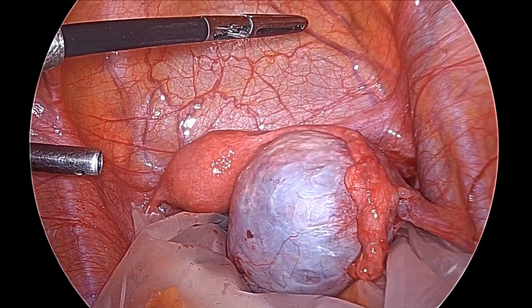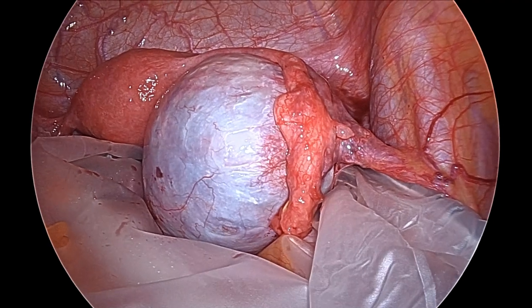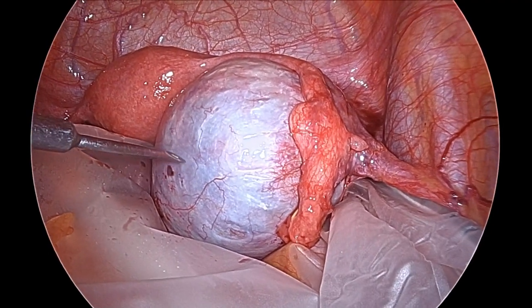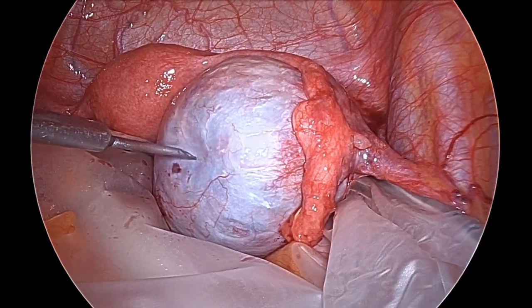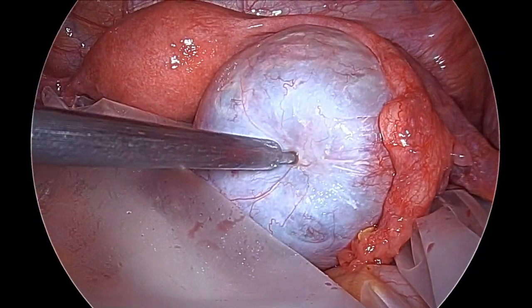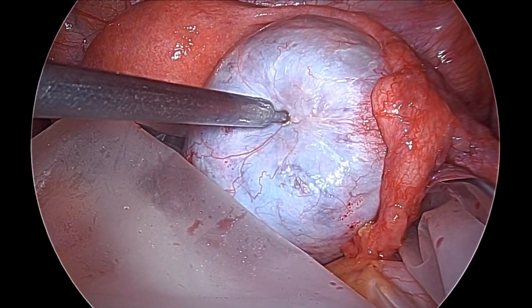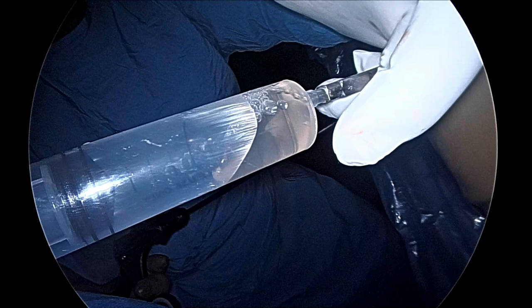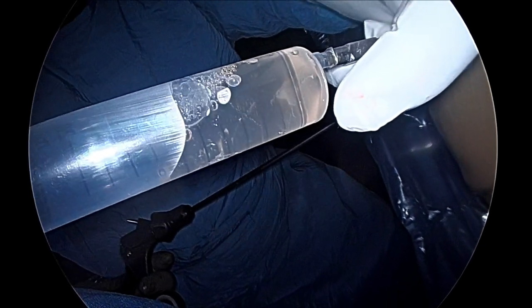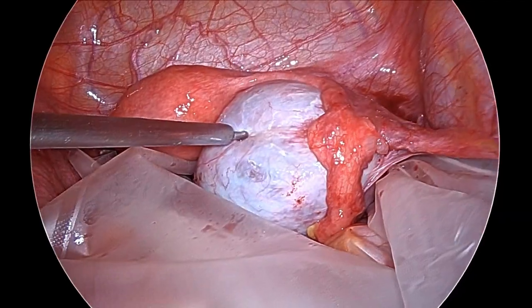Now we will aspirate to check the consistency of the cyst content. The aspiration needle punctures the anti-mesovarian border. When we examine the syringe, it is a very simple cyst — just watery fluid came out. This is good news, confirming it does not have any suspicious cystic content.